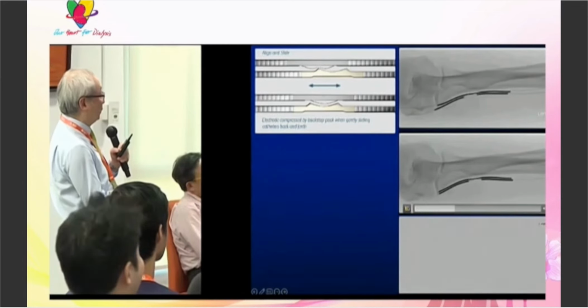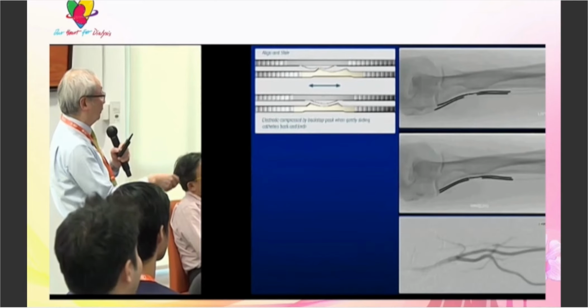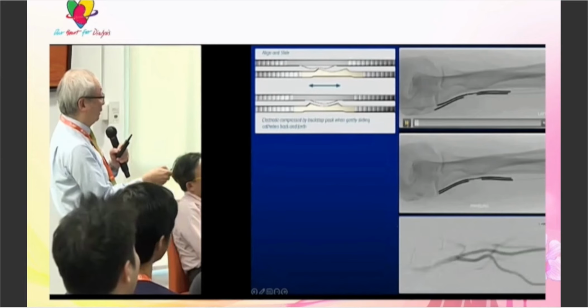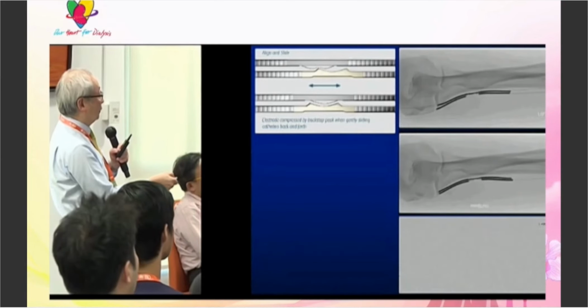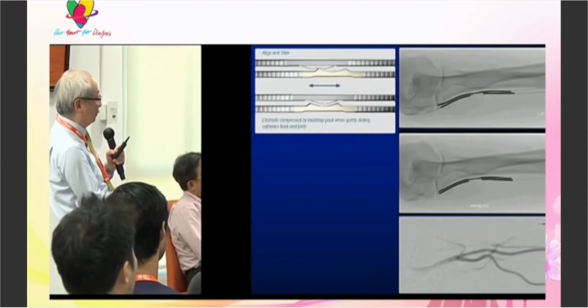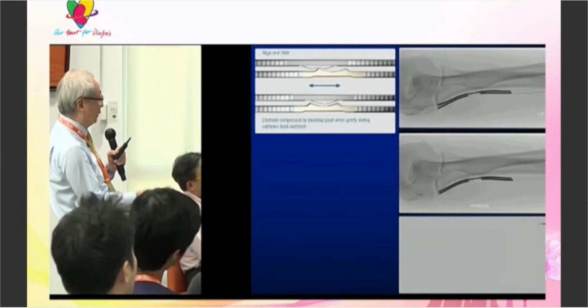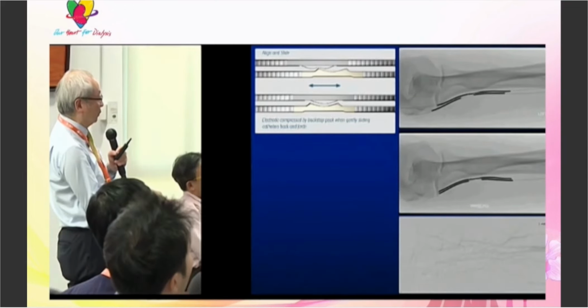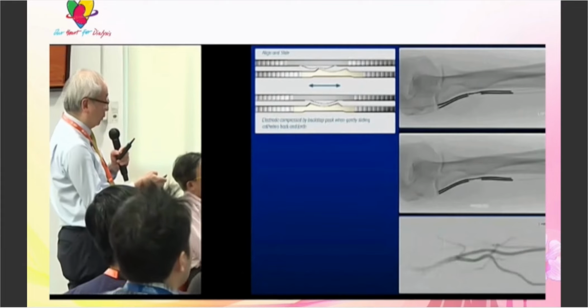So we do the usual back and forth. The very first one as well. Okay, so the usual back and forth. We thought we had it, but this one is during the firing. You could see that jump. But when we do the angiogram from the radial side, there's no superficial vein. So there is a problem with the fire.